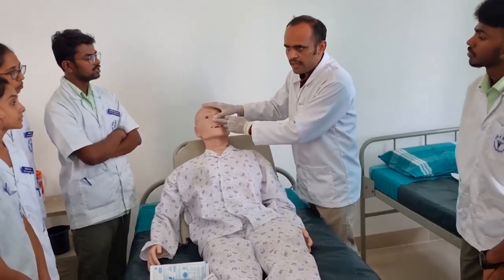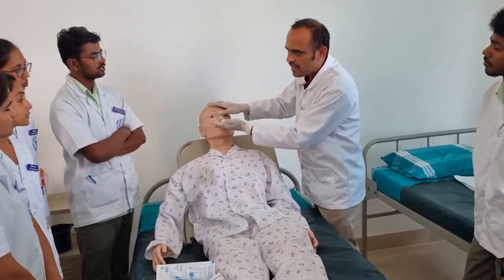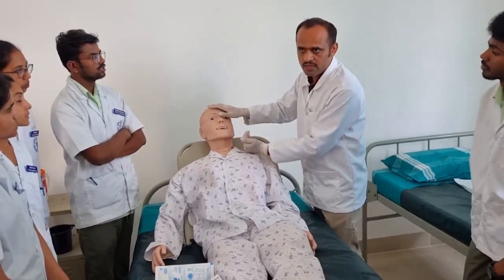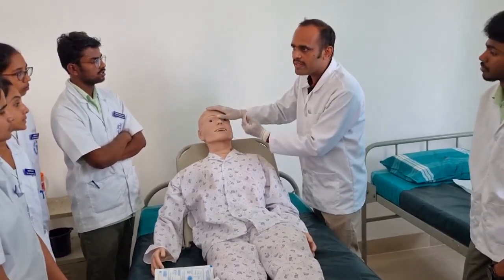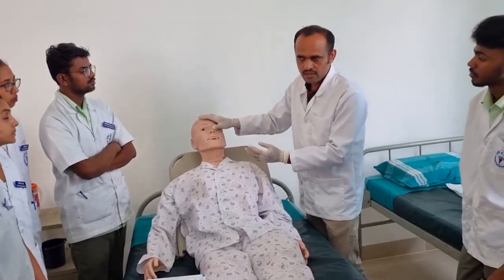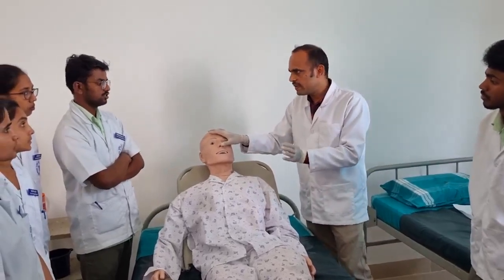If there is a nasal polyp or deviated nasal septum on any side of the nostrils, then in such a case we have to choose the opposite side of the nostrils to insert the nasogastric tube. Okay, so that is a very important point regarding NG tube insertion.